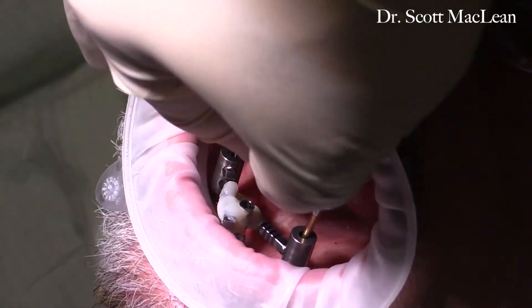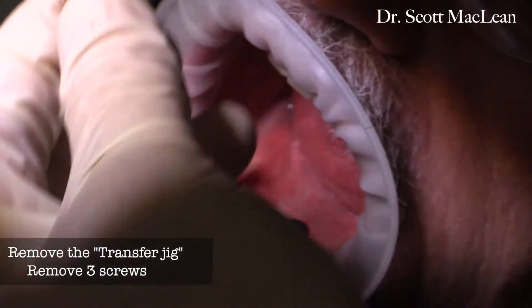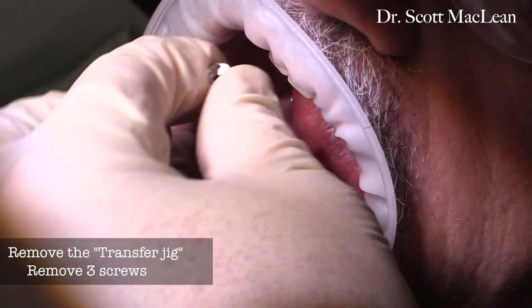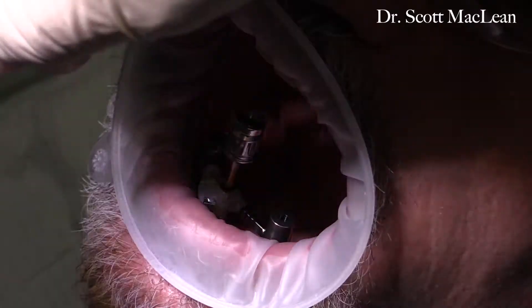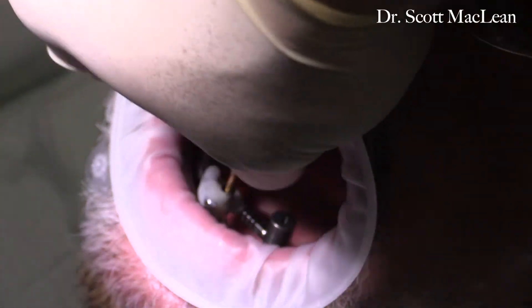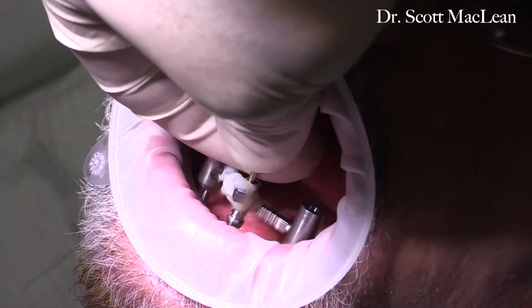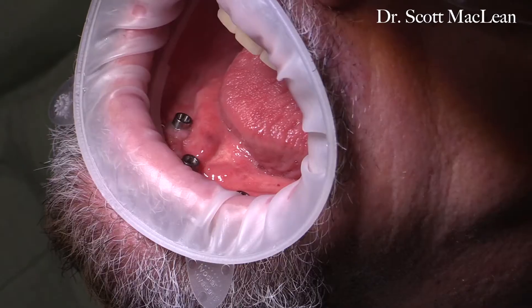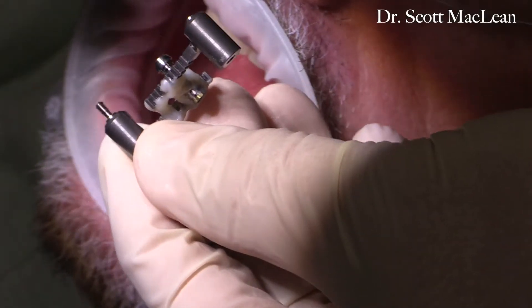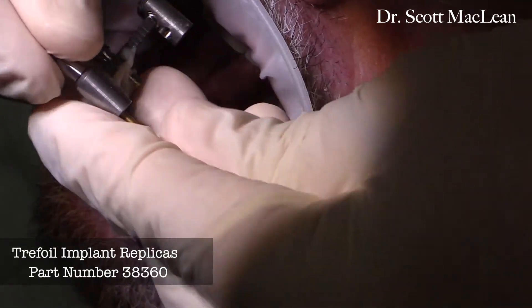Looking over the top, you can see a fair bit of resin holding this transfer jig. We'll remove the three screws and take it out of the patient's mouth. At this point the patient has sutures and bleeding, so this is an easy procedure because you're not relying on impression material to pick up the position of the three implants. You can see that one arm on the transfer jig is higher than the other, which allows the resin to engage in the proper area.